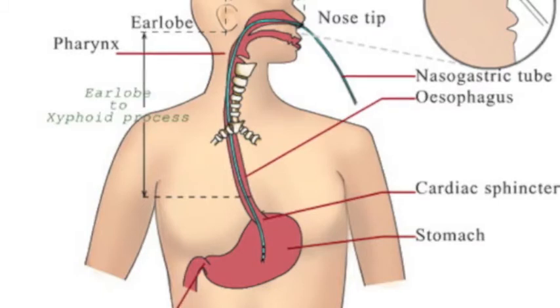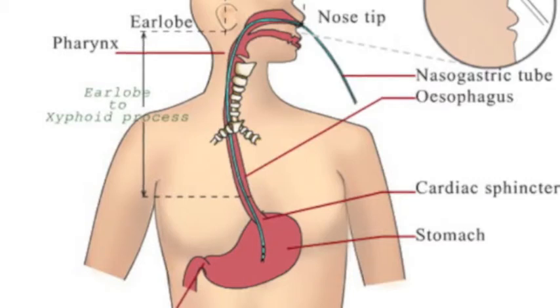If your patient should be NPO with this, you can tell if your patient has been drinking water because whatever the original color of the gastric contents was, it'll be like 2-3 shades lighter. And then you have all this return coming back, because basically you're just suctioning out whatever they put in. Right, they don't understand that. And then they'll say, I haven't been drinking water. I'm like, really?